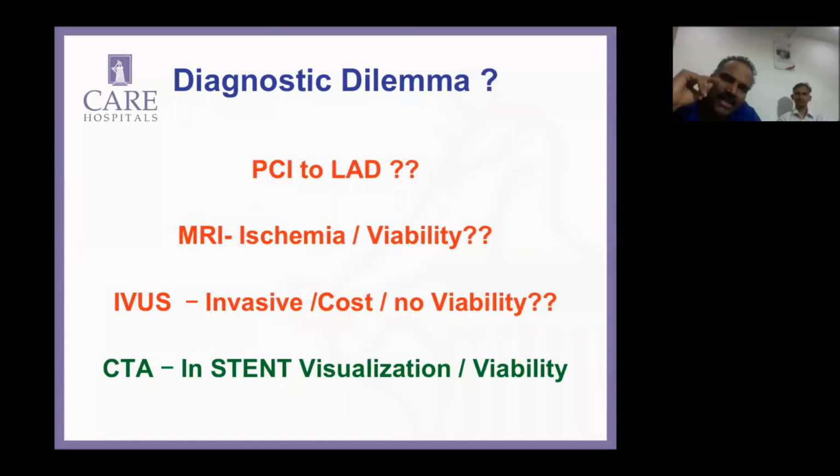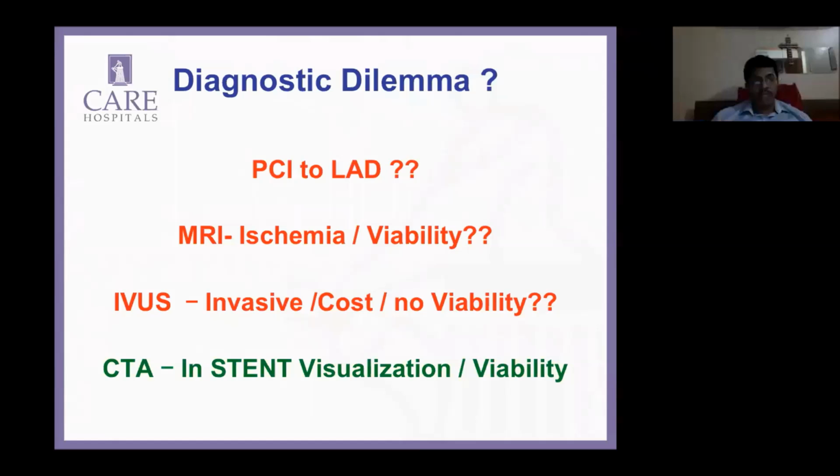If I leave viability, one more question I had in this angiogram is, see, the distal LAD is not visible at all in any of our views, either retrograde or antegrade, or there are no collaterals, and I'm not able to see any LAD. Yes. See, that is another situation where I want to know whether the vessel distally is good or not, before attempting anything. Correct. So that was the issue here as well, because it's an ostial flush occlusion.